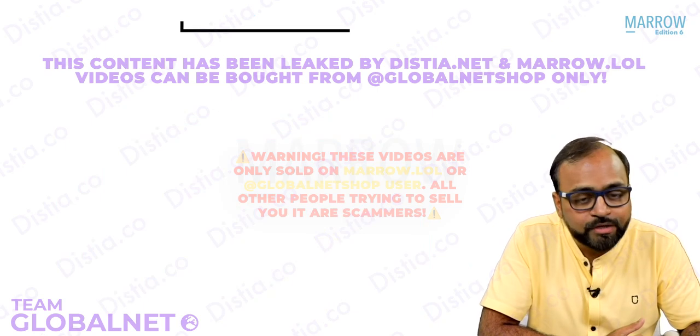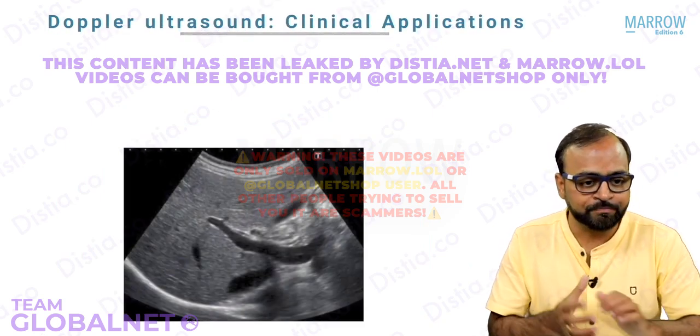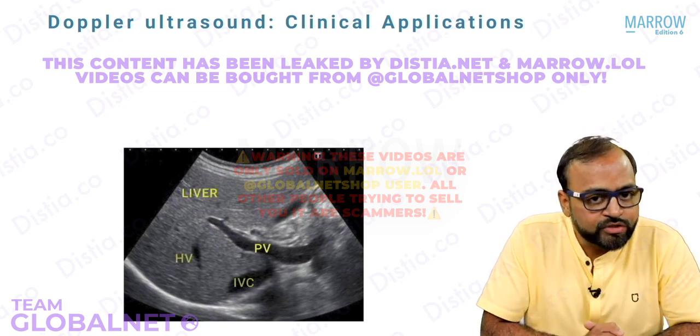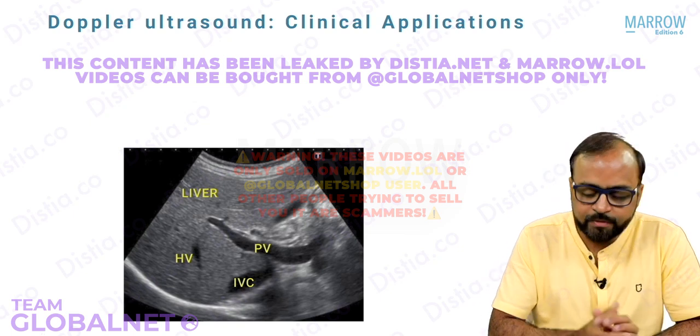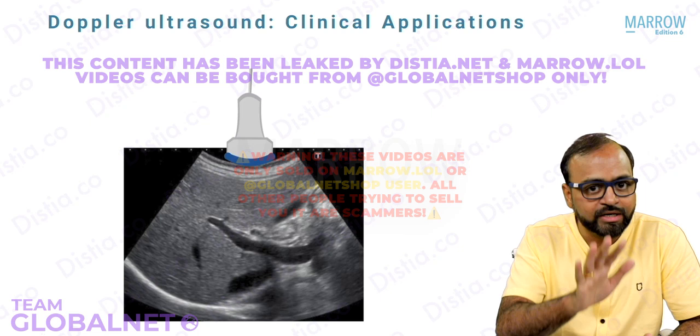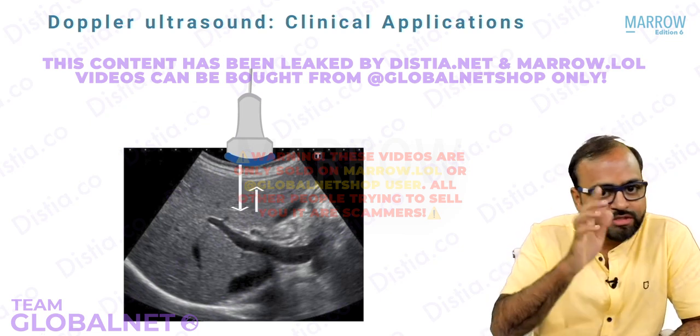Now, how is this Doppler effect used for diagnostic imaging? Let us take up an example of abdomen ultrasound. See here, suppose this is the liver parenchyma. This is the portal vein, hepatic veins. You are doing liver ultrasound. You keep a probe on the surface of the abdomen. The probe is stationary. Liver organ as a whole is stationary. So what will happen? A pulse is emitted, an echo is received.